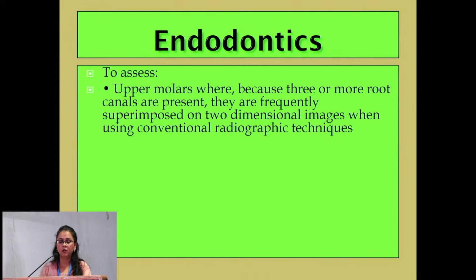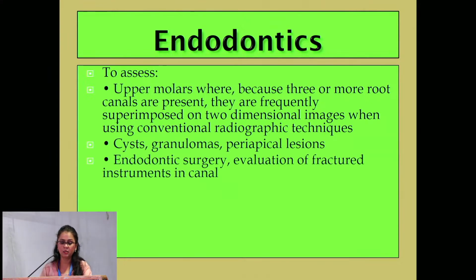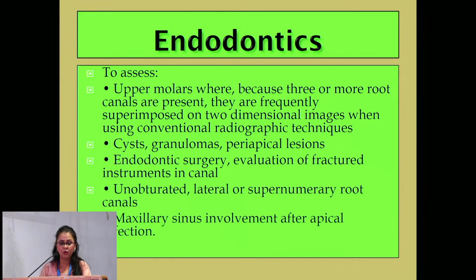Endodontics: for root morphology, for canal assessment, for the assessment of any periapical lesion associated with the tooth, unobturated lateral or supernumerary root canals, or any maxillary sinus pathology, whether the sinus pathology is odontogenic or non-odontogenic.